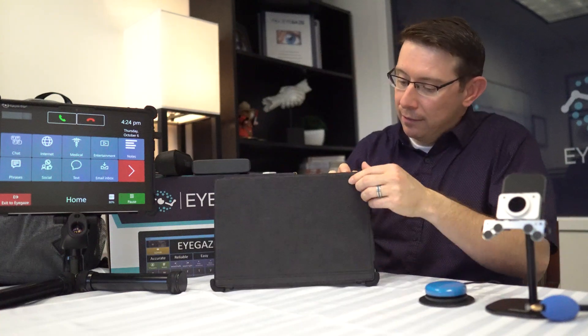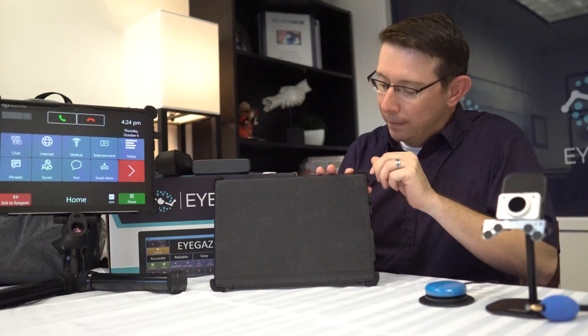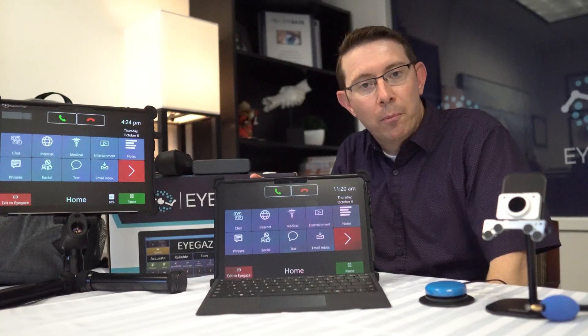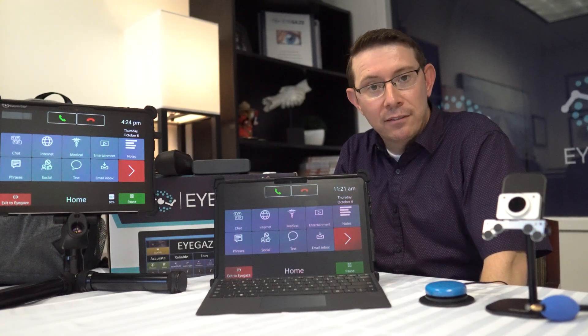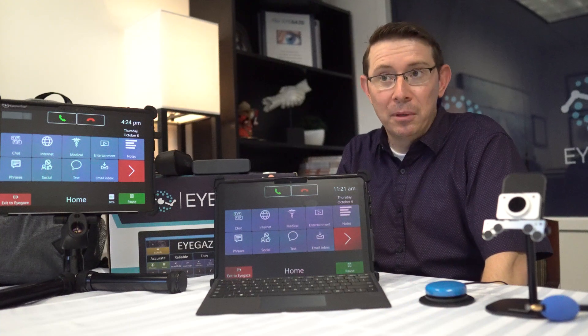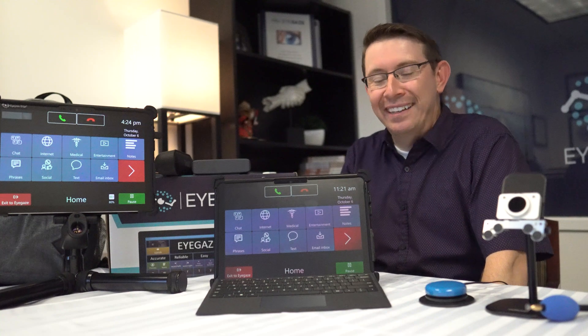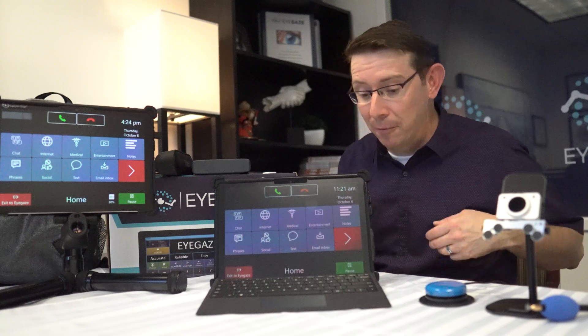This keyboard acts as a protective screen cover when you don't use it. Every iGaze tablet comes with our iWorld software program, which allows access not only to communication, but also to the internet and online shopping, social media, text message, email, games, and a library of symbol-based pages if this isn't going to work for the communicator.